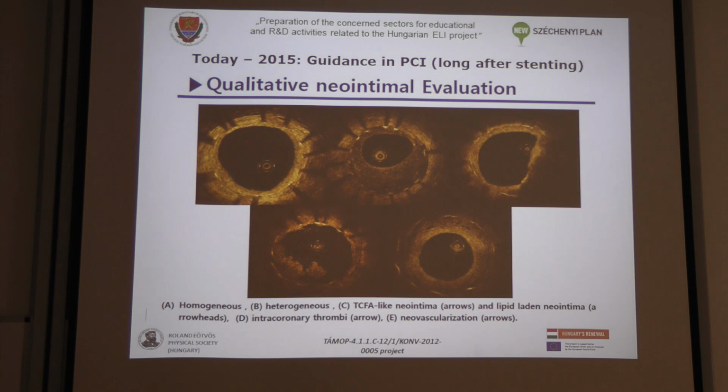Today we really try to describe it correctly and what is the mechanism, because sometimes it is not the so-called neo-intimal hyperplasia which is responsible for this stenosis regrowth, but sometimes the stents are not strong enough, and maybe the outside forces in the long term cause a so-called chronic recoil of the stent, and the interventional management is quite different for the two.